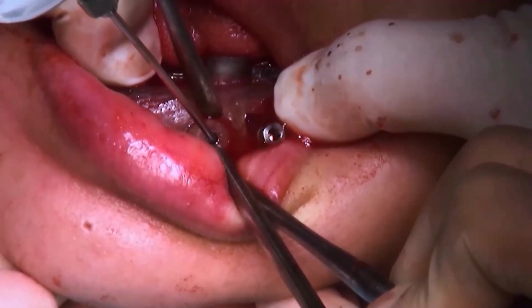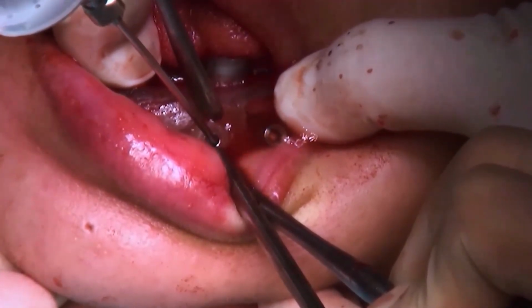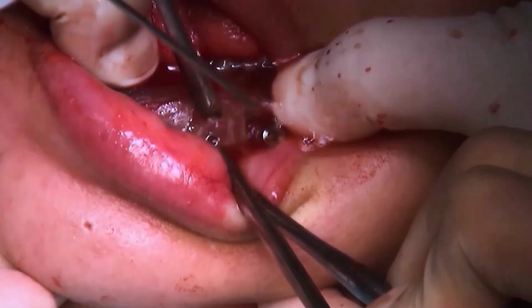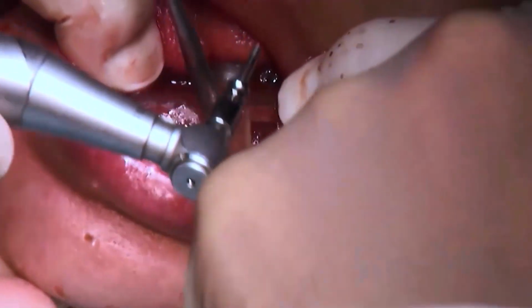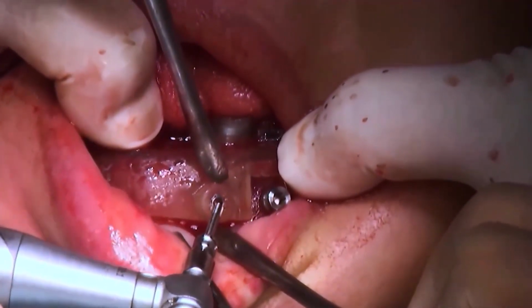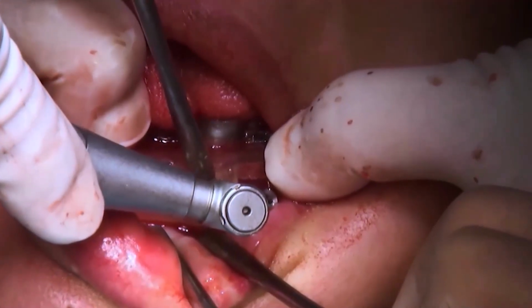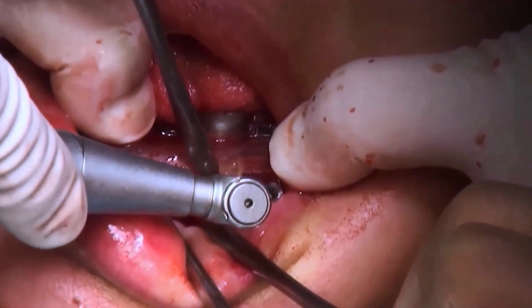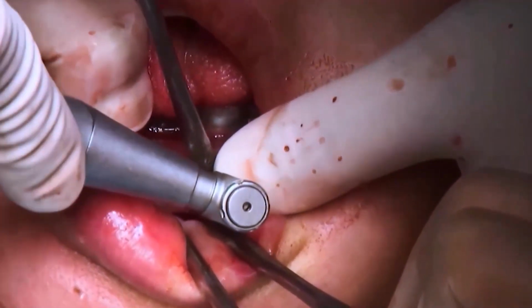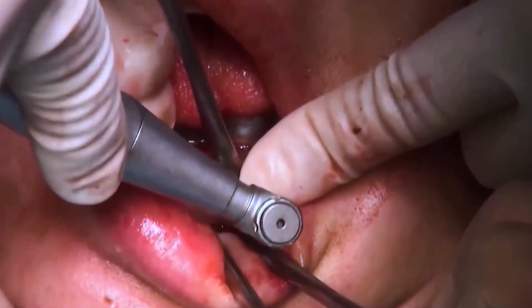Irrigation is done to remove the debris and to cool the site. Two anchor screws are used to fix the foundation part. Another two anchor screws are used to fix the surgical guide part.